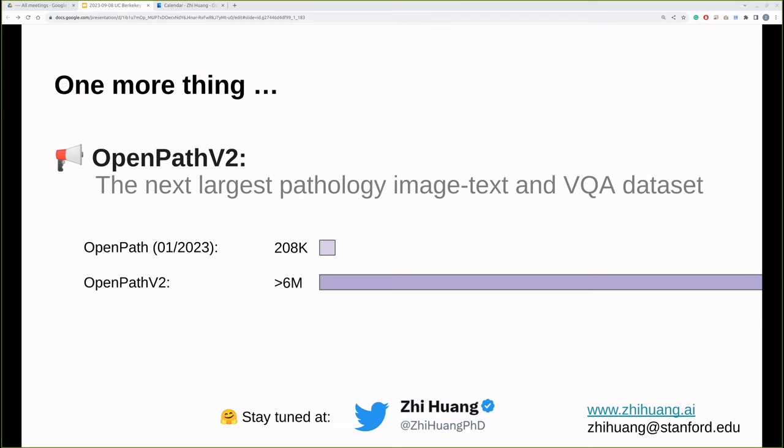I see. I think this is a great question. Pathology images have different staining types: H&E and immunohistochemistry. On H&E, some molecular features can be observed, such as microsatellite instability. Some people are working in that field. I think molecular features would be extremely more helpful in immunohistochemistry images. When you have an IHC image and you know what antibody was used to stain it, based on the antibody, the clinical history and the staining result, we could infer more about the image. That's something that can be very helpful for IHC, I think.